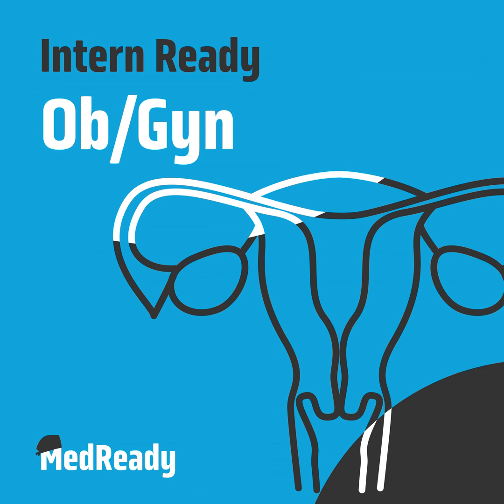Once you're actually doing the hysteroscopy, the complications that you're always going to want to be aware of, and that your attendings are going to be aware of while you're there, is one, uterine perforation.